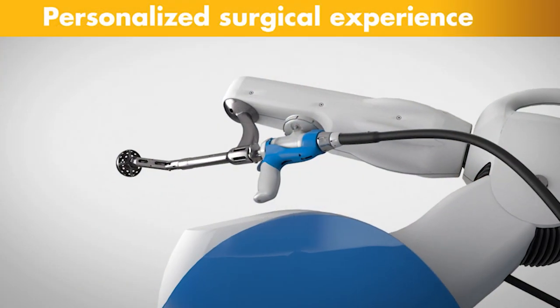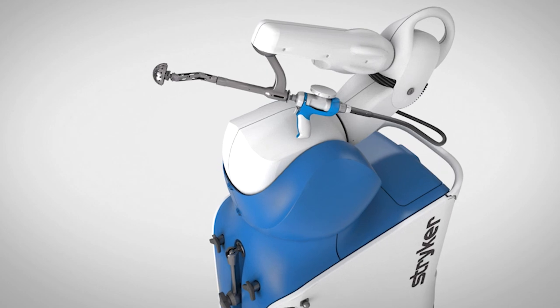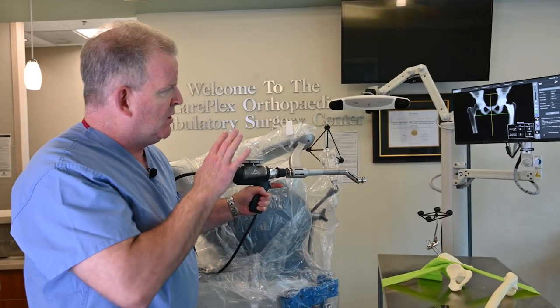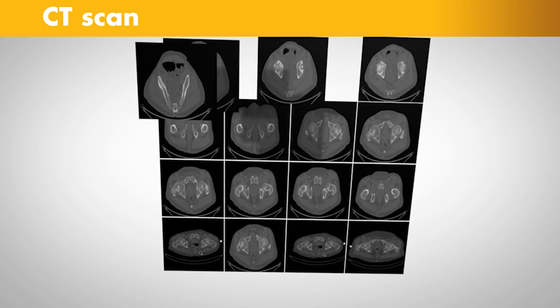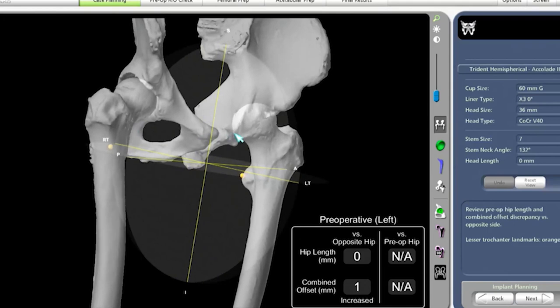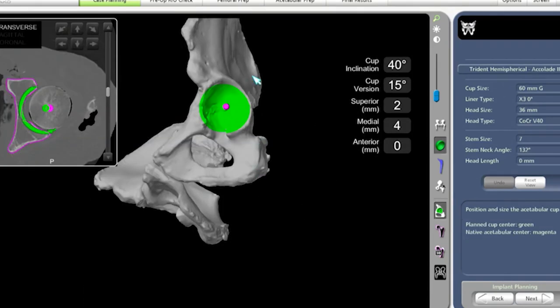Here's the Mako robot, and you can see that it's got a robotic arm that allows us to move. One of the exciting things about Mako robotics is that you get a CT scan of that joint beforehand. Some people think that's a downside. I think that's only an upside. You get three-dimensional anatomy, and you get incredible precision in your preoperative planning like no other device or technique. That kind of precision, no other technique can match.